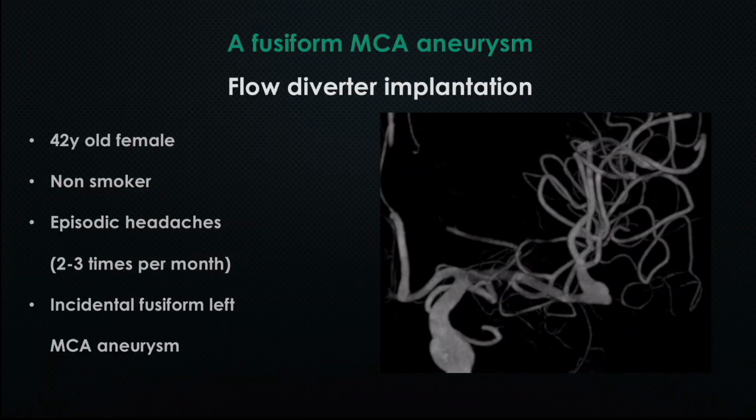Hello, dear colleagues. My name is Al Mohammed, and today we have a fusiform aneurysm of the left middle cerebral artery, a young female patient with no medical history.